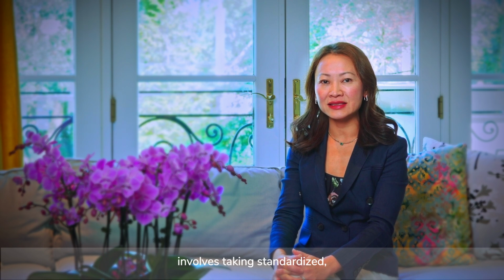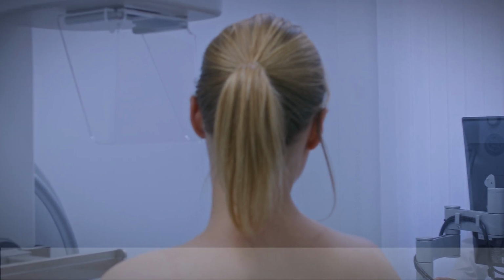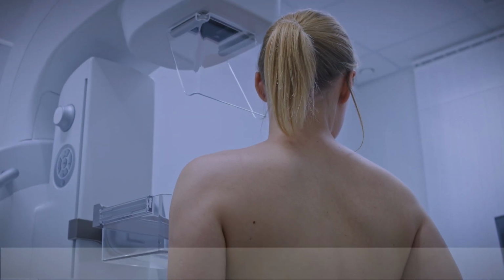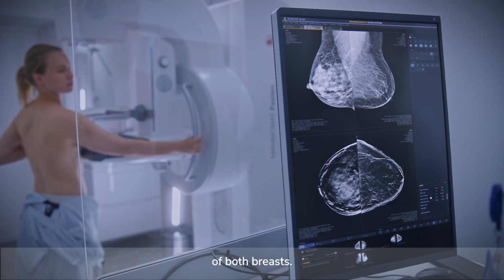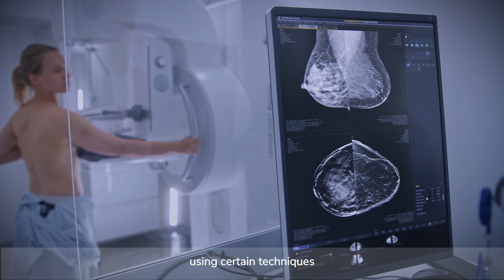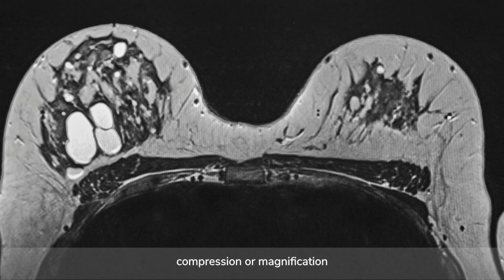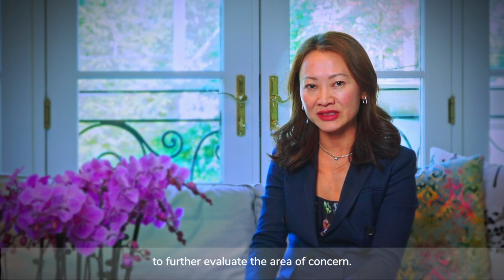A screening mammogram involves taking standardized multiple images of both breasts. And again, this is regardless of whether you have symptoms or not. A diagnostic mammogram involves taking additional views of both breasts, and this could include using certain techniques known as spot compression or magnification to further evaluate the area of concern.